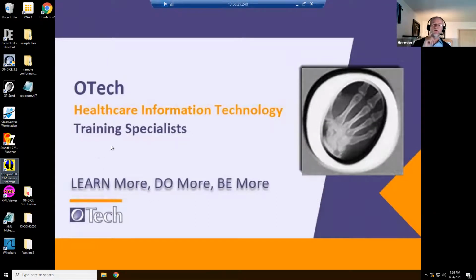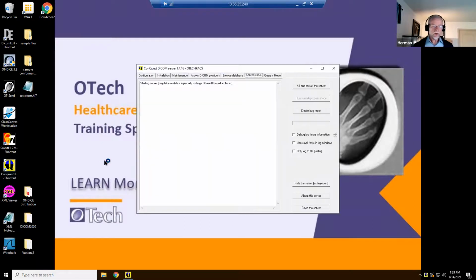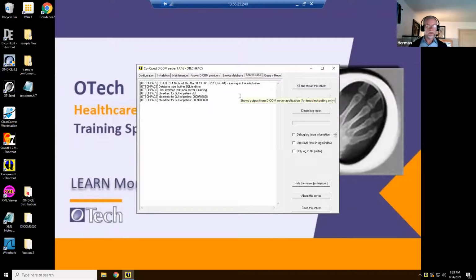By the way, everything I do today you can do yourself, at your home, at your office, at your business, wherever it is, because I'm using open source components, except for the simulator. We use an open source workstation, and we use an open source PACS, in this case a free PACS you can download from the internet. We use Conquest. Conquest is the PACS, so that will be the destination. I like Conquest because it's very easy to install. It literally takes 2 minutes, and it gives a very nice status screen, so you can see what's going on.